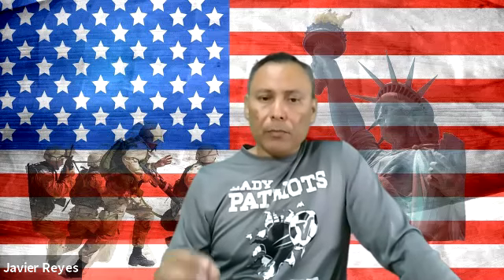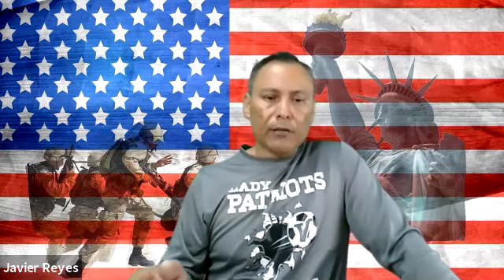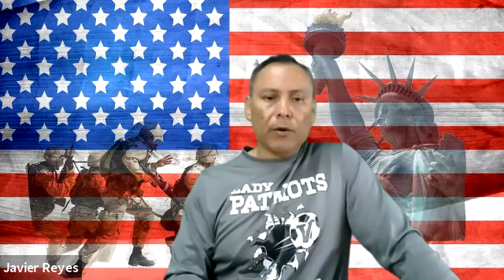Well, as you know, the red blood cells, when the blood is still whole, all the cells are still working. The cells are still alive, and they're eating everything that is in the blood, your sugar, your electrolytes, and all that kind of stuff. And there's a lot of other chemicals that can grow if they're left sitting too long. So again, that is why it's very important that the cells are separated from the plasma or the serum right away. Okay.